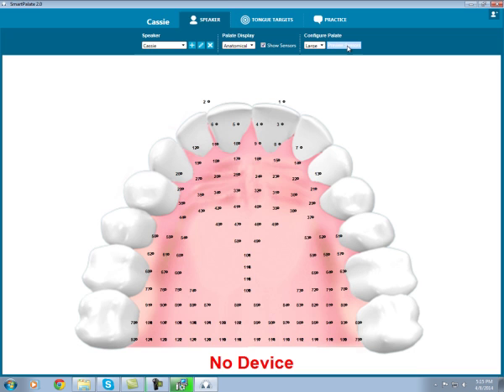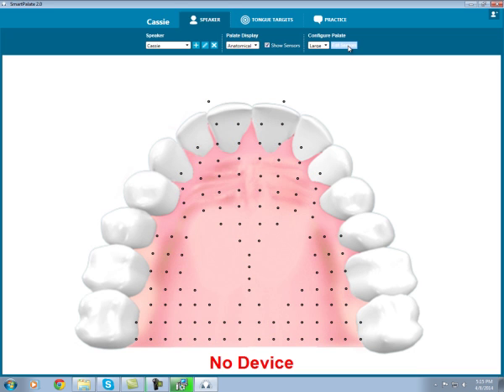You can preview any sensor changes that you've made. And if you wish, you can change the palette display from large to small. But more often than not, the default large palette will be the best fit. Next, let's look at the practice tab.